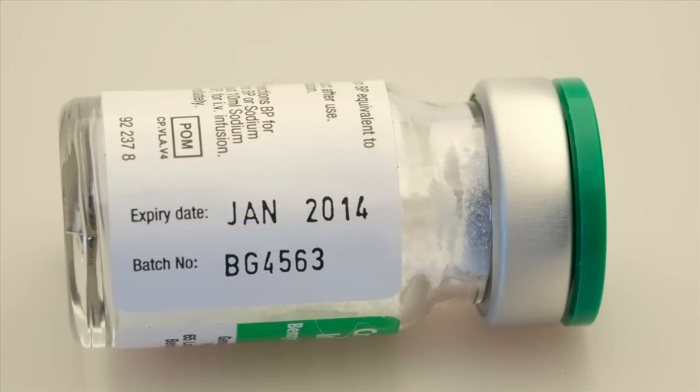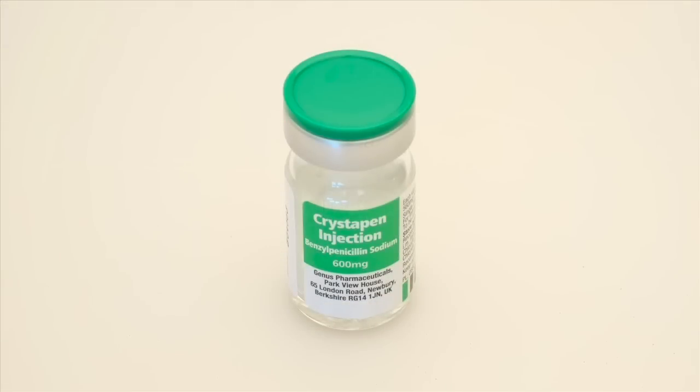Wash your hands, wear gloves, put on an apron. Check expiry dates, damage to any containers, vials or ampoules, and check that the medicines were stored correctly such as in a refrigerator.